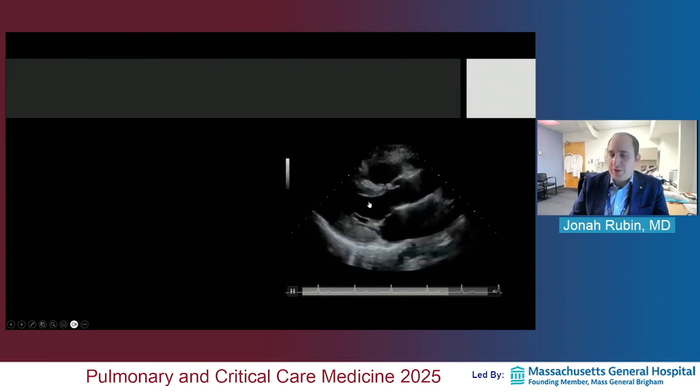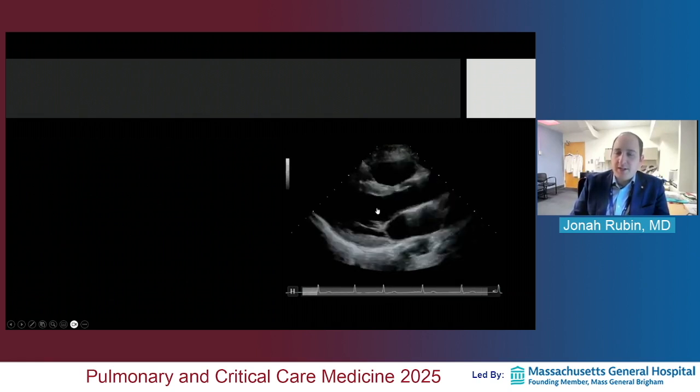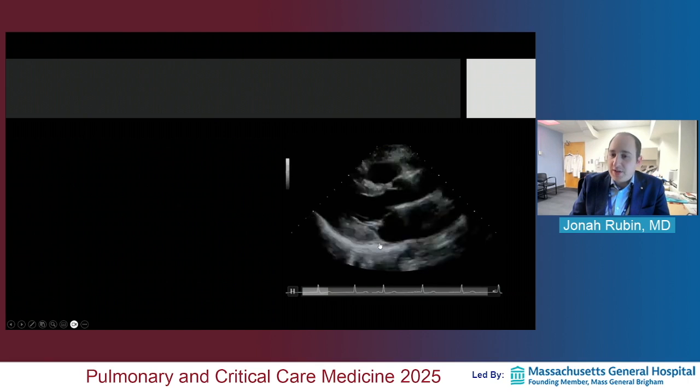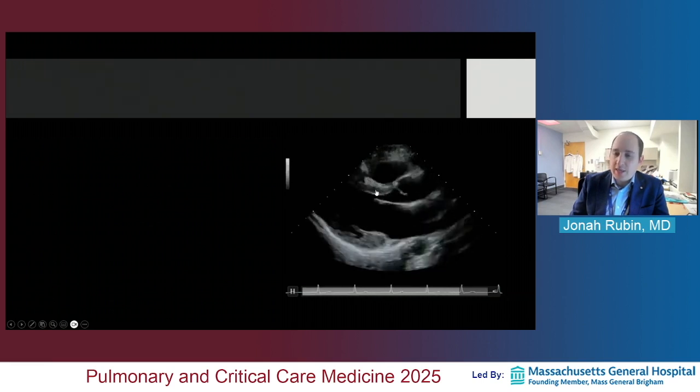And when I'm looking at left ventricular systolic function, and this is a normal echo, this is taken from the ASE prototypical normal echo, most people sort of jump at what they would consider to be the EF, where you just sort of get a sense of how much is being pumped out here. You should be very cautious about that because on just one view, I'll share with you there are 17 segments of the left ventricle. I like to joke that it's less complex than the lungs, which have 18 segments. The heart has just 17. You're only seeing 4 segments on this view. I'm not going to go through them here. That's a bit more advanced. But just to share, you're seeing less than 25% of LV function. So you don't want to make any call from one window for anything, but that sort of illustrates why you wouldn't want to make an LV function call here.